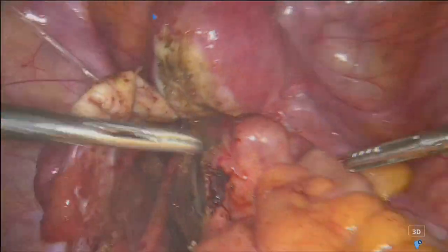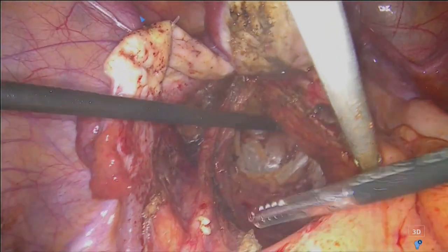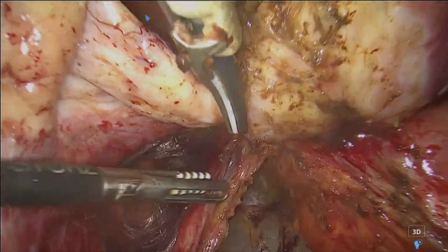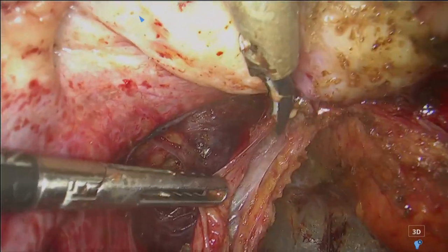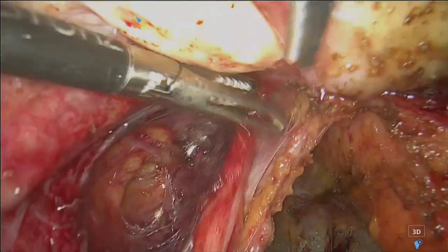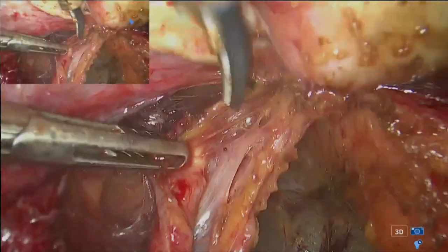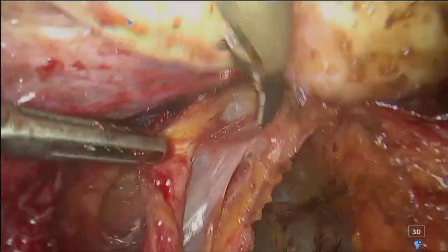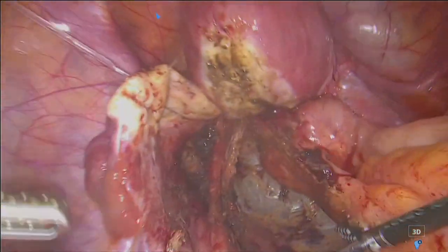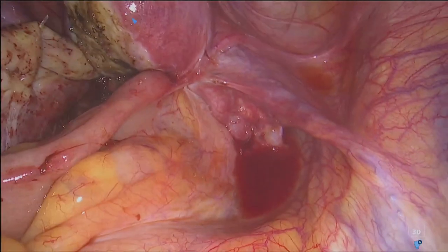Okay. So you see that on the left side we did, I think, a very good job, and it's all prepared on the left. The ureter is under vision. Probably we can free a little bit here. So the ureter goes laterally, more laterally, and we are safer in the preparation of the retrocervical nodule. Very good. Okay. Now we go to the right side. You see that we can do the aspiration of the fluid.